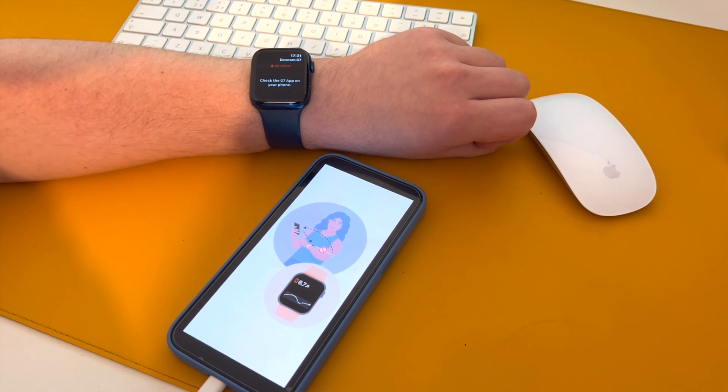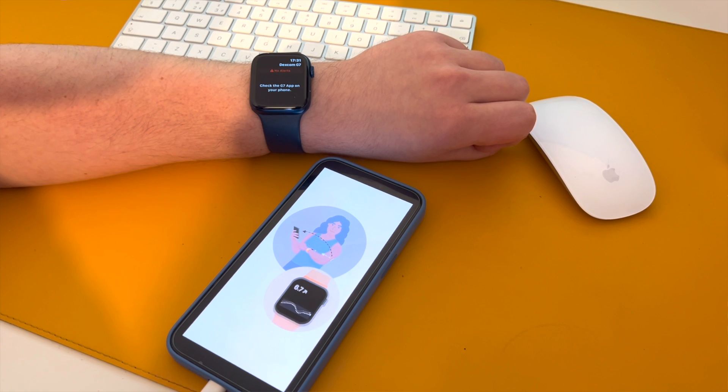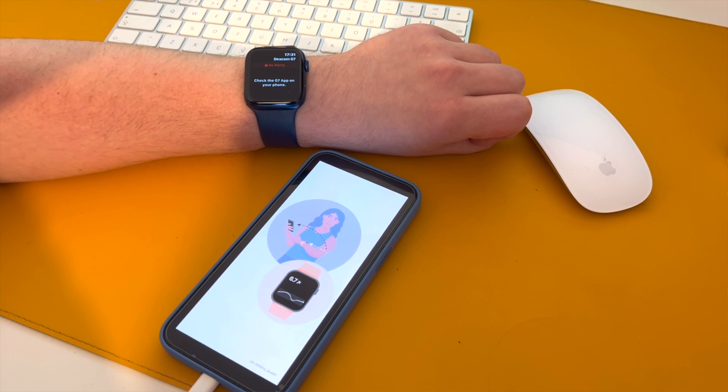You just update the app in the App Store, and that sensor works with Direct2Watch when you leave your phone. You just do it the first time to set it up, and then automatically every time it changes the sensor.